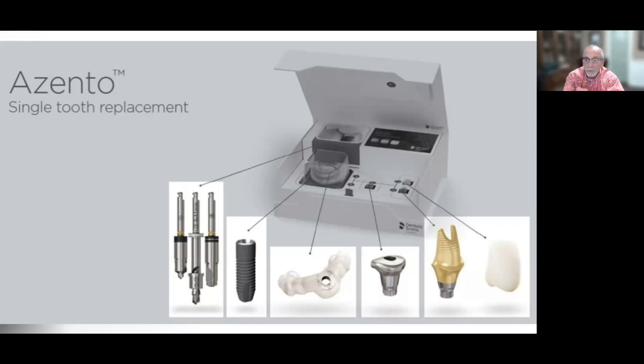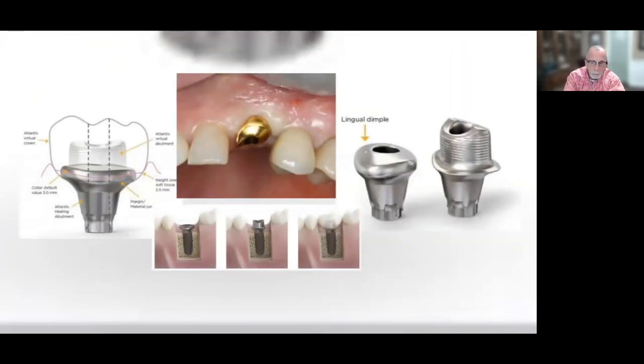So it's digitally created. It's not created by me chairside or by a technician or by you having to worry about it chairside. And it's custom sculpting the tissue to that ideal position. And if you want, you can ask for a final full-size abutment as well if you want to put a temporary crown on it. This is a wonderful workflow for a single tooth.